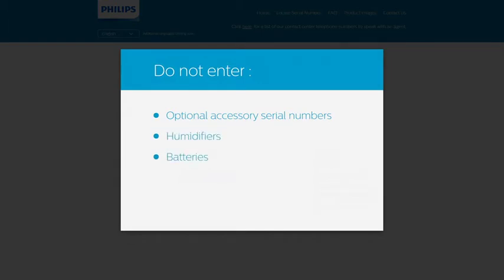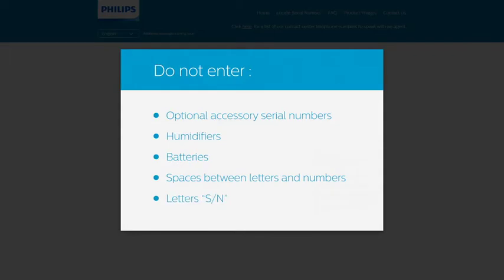Do not enter: humidifiers or battery serial numbers, spaces between letters and numbers, or the letters SN.